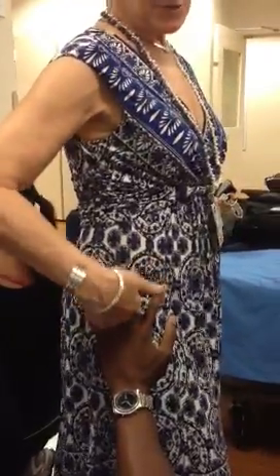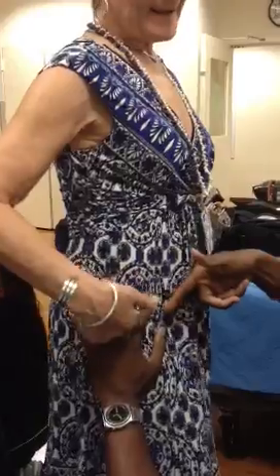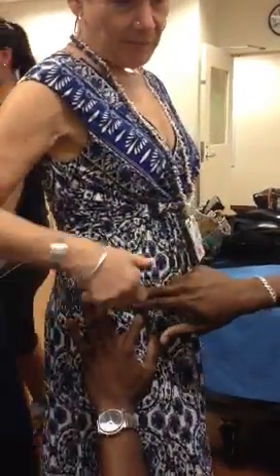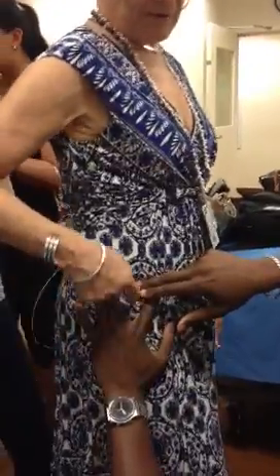See, my habit is once I feel the actual spine here, I feel like I'm in location. No, you're not, because you're going to give it up here. This is where you have total bone, so you have to give it down here. If you don't have this hand on the trochanter, you're going to be too high.